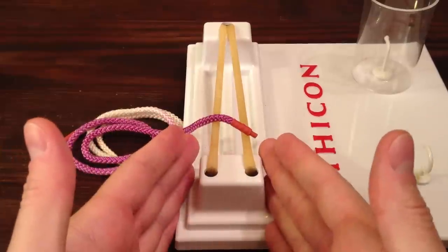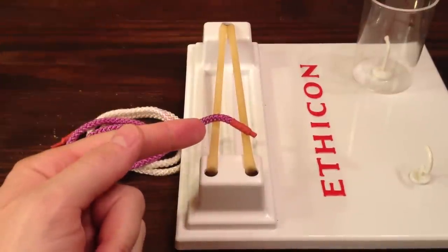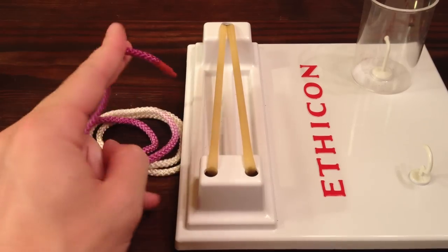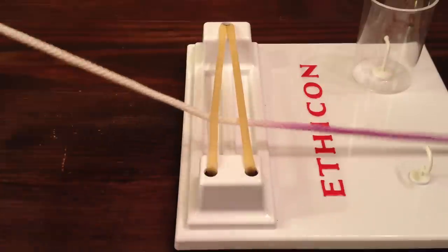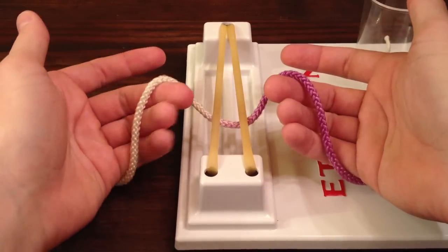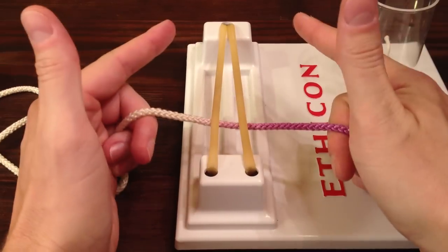I like to orient the incision pointing away from me, and in all my videos the needle is going to be attached to the purple string. So lefties, you're going to grab your needle driver in your left hand, grab the needle, and suture from left to right, putting your needle on the right side of the incision and the white end — the free end — on the left. To grab the string, I like to use the pistol grip. You're going to grab both sides with the bottom three fingers of each hand — looks like two guns.